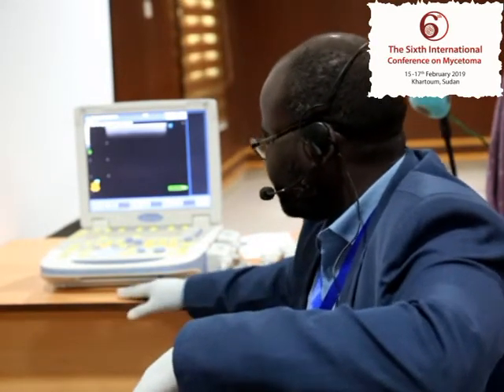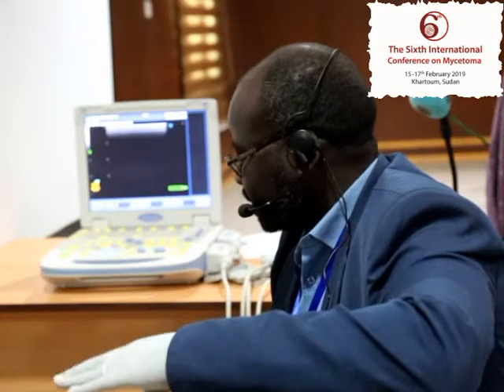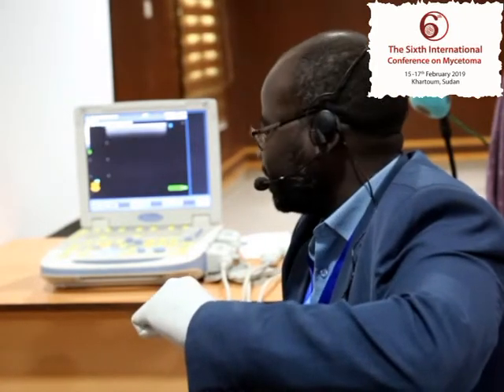So as you can all see, this is a machine. You can put it on a tabletop. It has a trolley which is located there at the center. You can take it in a bag. It's very compact, it's very smart, and fortunately, most ultrasound machines are very durable. It's very rare for an ultrasound machine to get ruined, destroyed or malfunction.